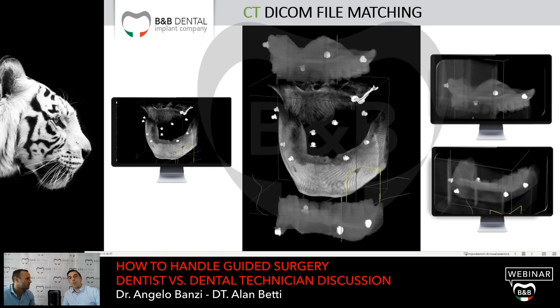Do you want to give us some details? We have already said we transform the DICOM file of the radiological template into STL files. Both of them or just one? Both of them, upper radiological template and lower radiological template. The question, maybe very interesting for the technician, is: do you have to transform both exams, I mean, the first one of the patient wearing the radiological template, or just the radiological template? No, just the radiological template, both upper and lower.